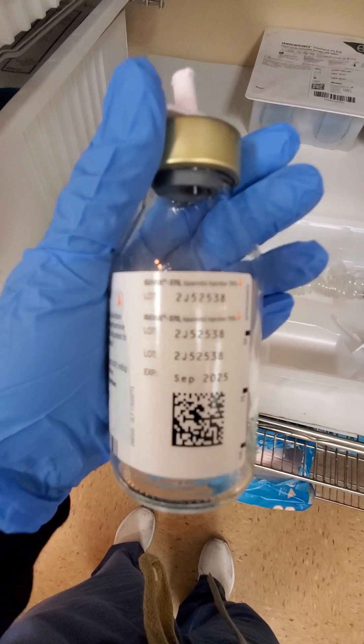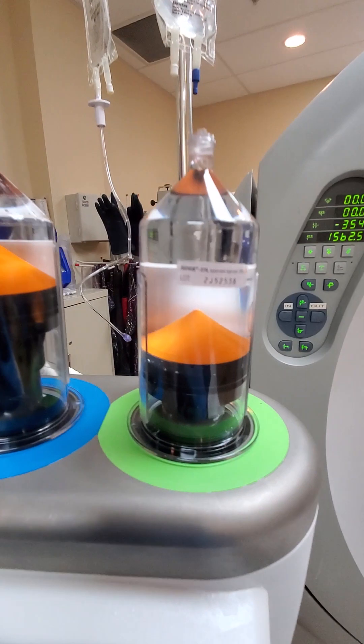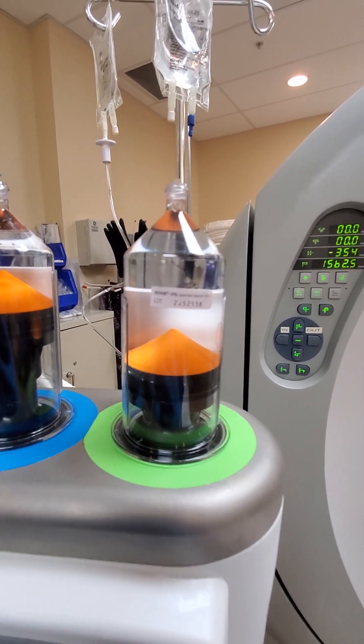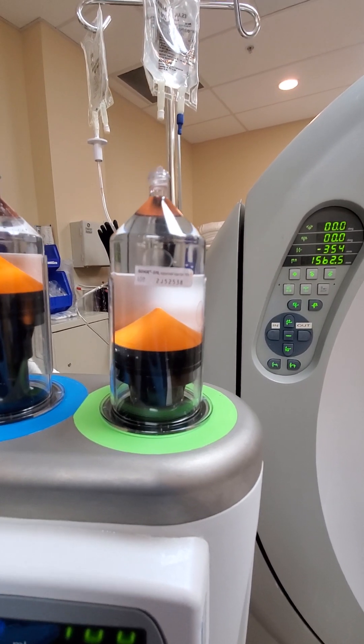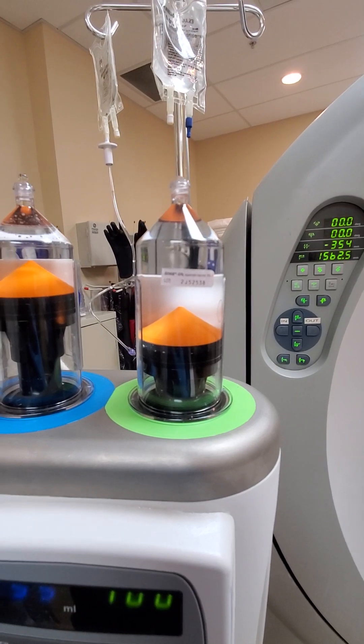The contrast has these stickers back here that you will stick on to the cylinder. Just in case the patient has a reaction and we need to trace back which lot the contrast came from.